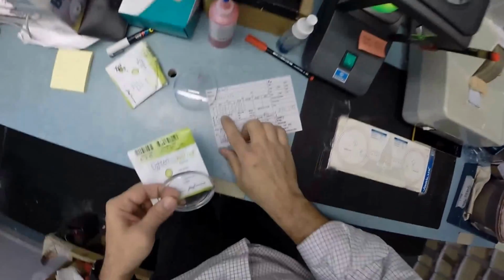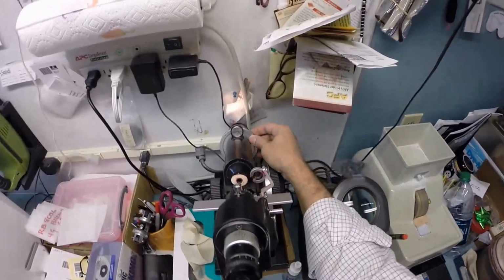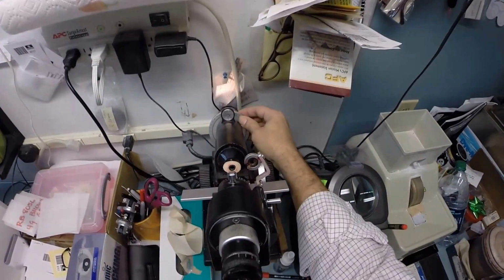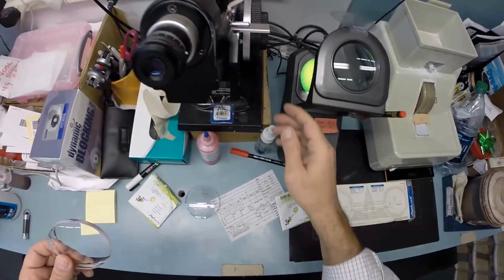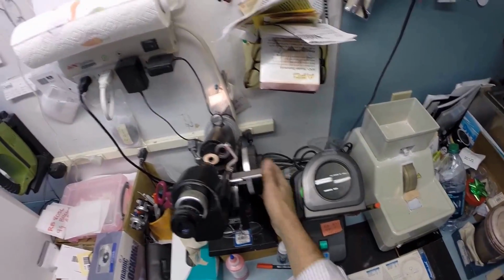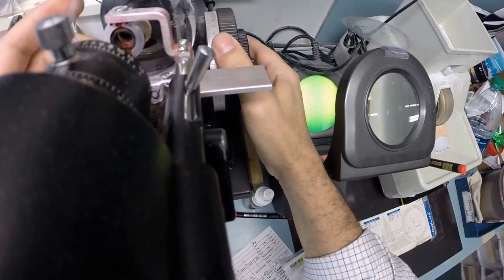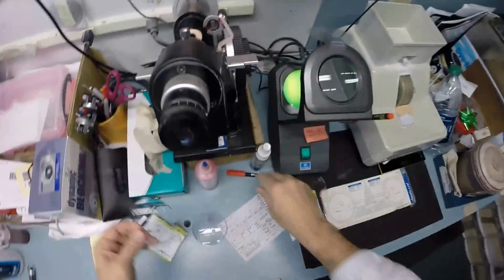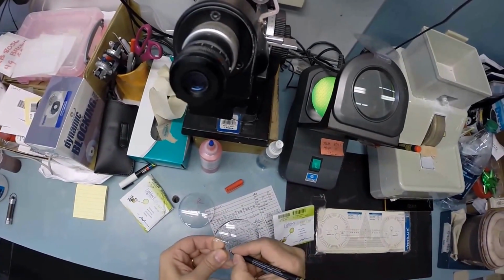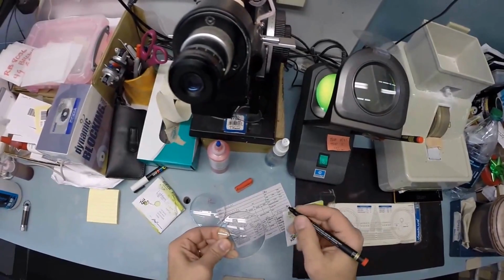Okay, so your left lens, -3.25, -1 at 105, not 115, 105, and you will find that between 100 and 110. So let's turn the power drum to -3.25. Put your lens in, rotate it until the sphere power comes in clearly. Check your astigmatism correction, also known as the cross curve. Put 3 red dots on your lenses. Darken those 3 red dots. 1, 2, and tres. Uno, dos, tres.